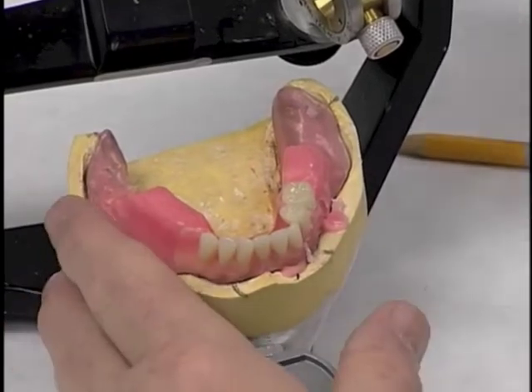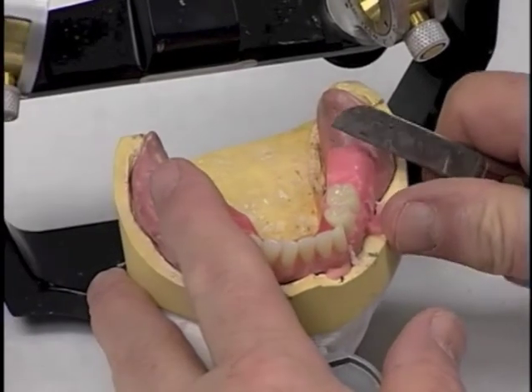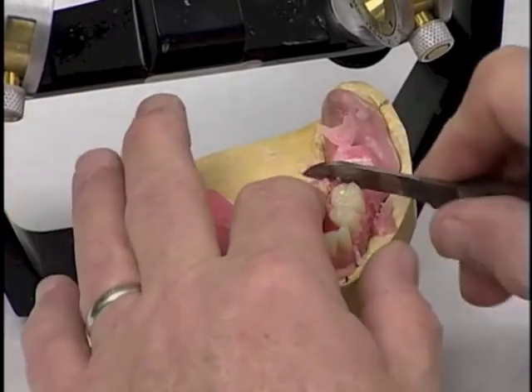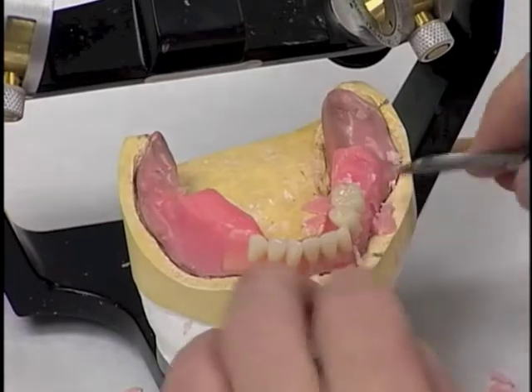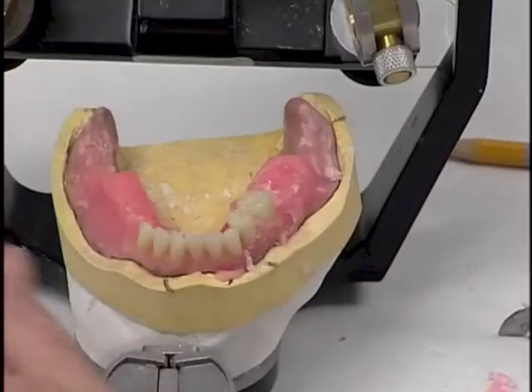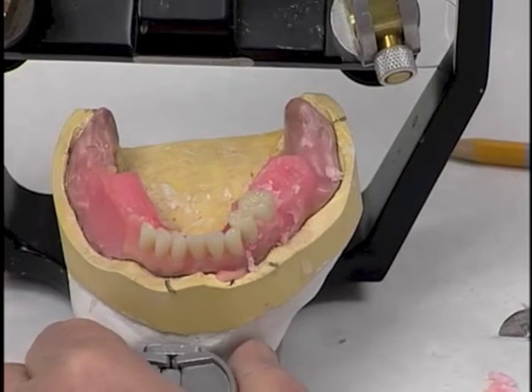Now we're going to remove wax for a second molar. Pull the wax in the vicinity where we would like that second molar to be arranged.